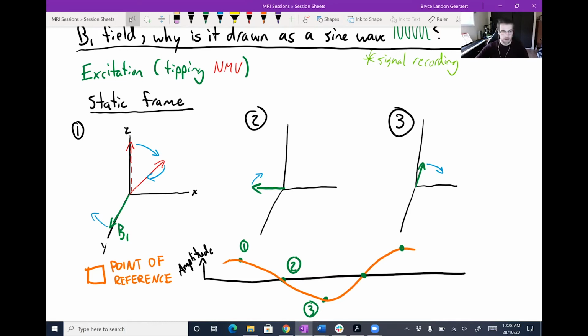There are other factors that are going to be influencing your NMV magnitude, but they are a little bit more detailed than the level I'm talking about MRI right now. But one thing I'm just going to run by you is that the type of tissue that you're in also affects how many extra protons are in the up orientation. So when you're considering a net magnetization vector, there are different amounts of magnetization contributing to that vector from different tissues.